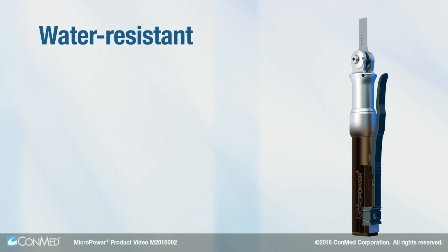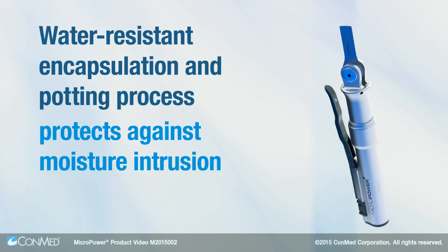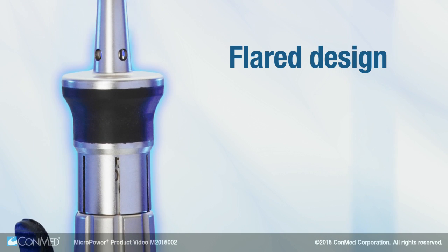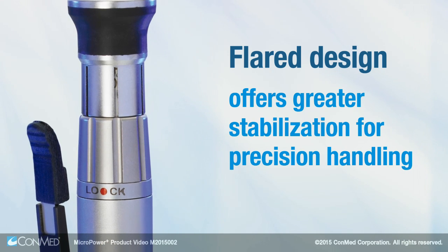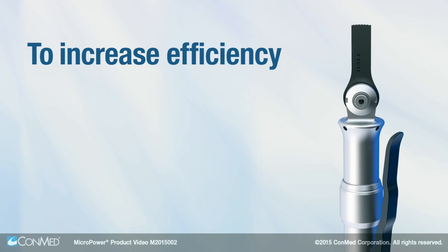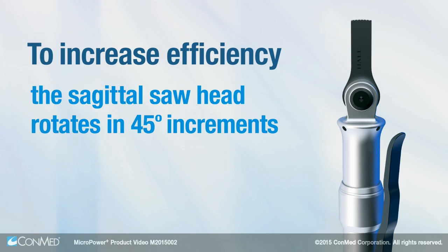A water-resistant encapsulation and potting process protects against moisture intrusion. The flared design of the handpiece body and burr guards offer greater stabilization for precision handling. To increase efficiency, the sagittal saw head rotates in 45-degree increments.